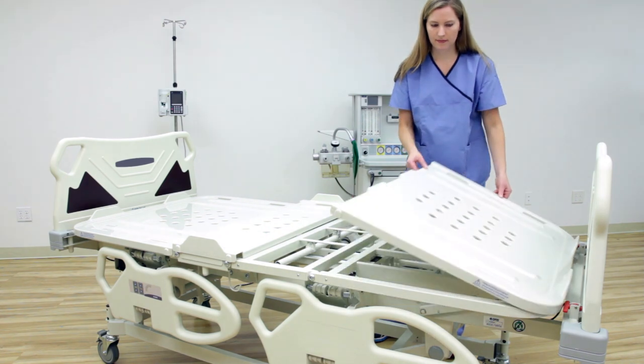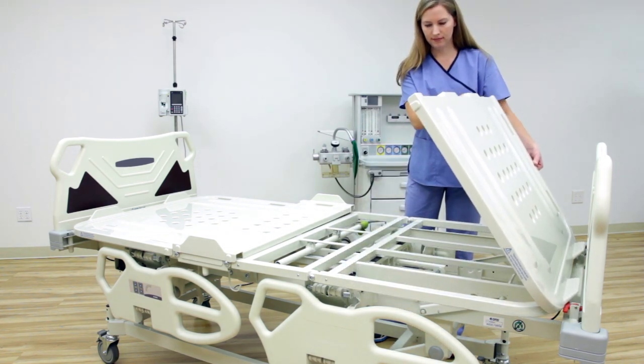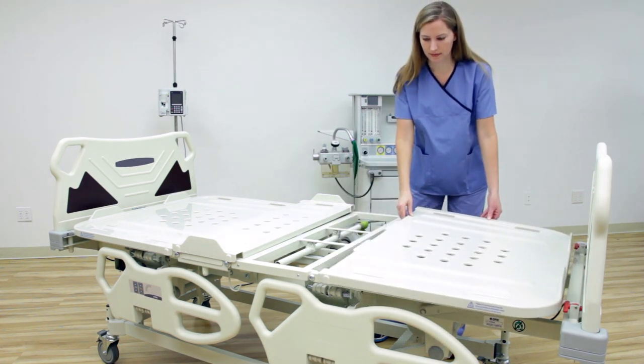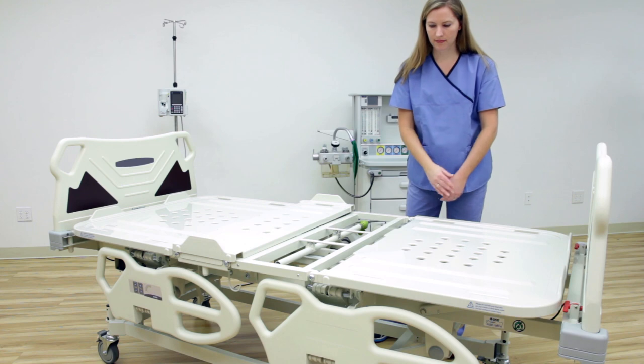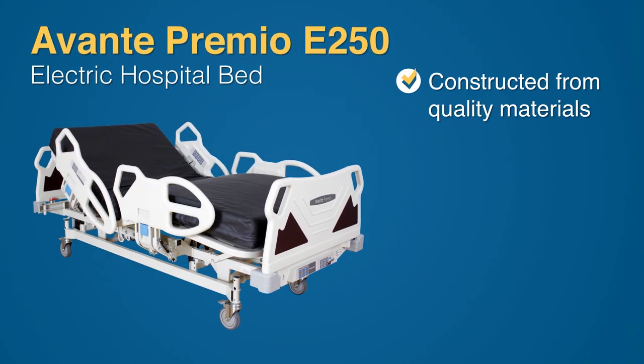The Premio's bed frame is constructed of powder-coated steel for durability and longevity. The removable mattress base parts are made of ABS plastic. The Premio E250 hospital bed's quality construction promises durability and high performance for years to come.